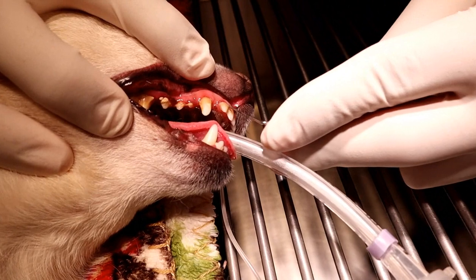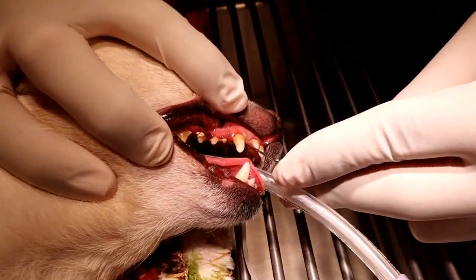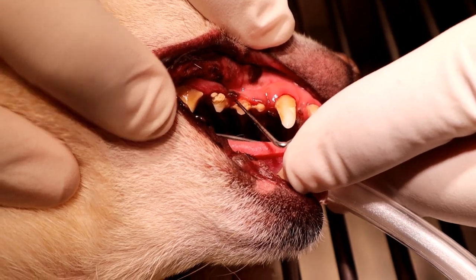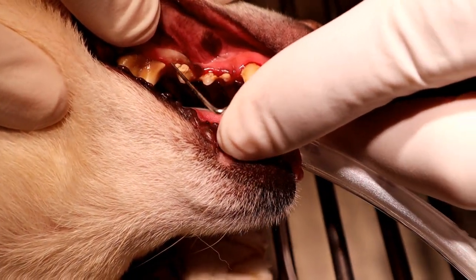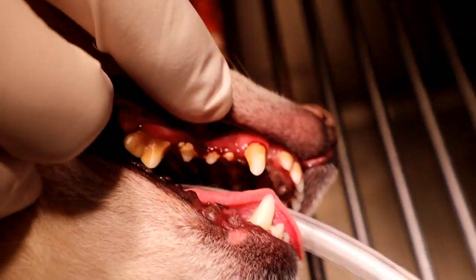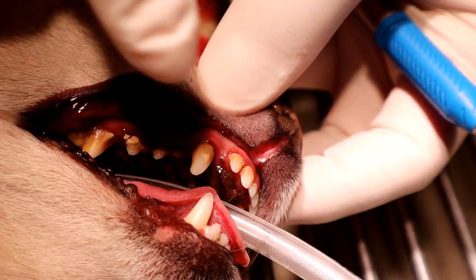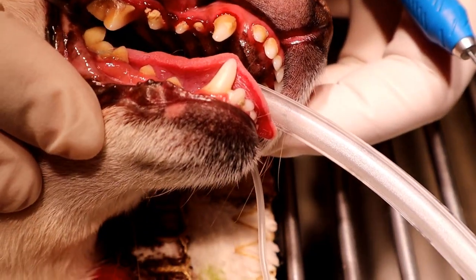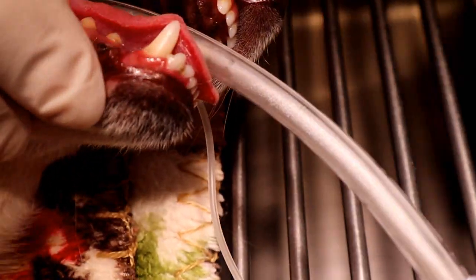I just start with probing these teeth, going around the base of the teeth. Most periodontal disease is under your gum line — pathology lies below the gum line. And you can see as I just gently poked those, they started bleeding because of all that tartar down there.